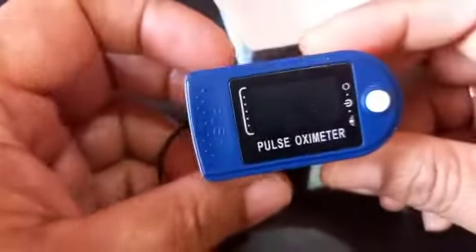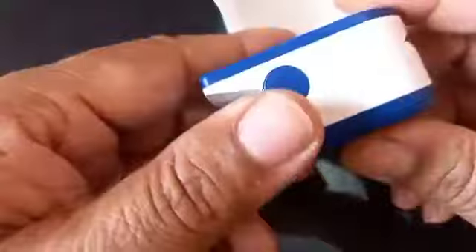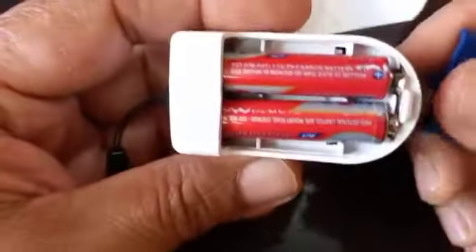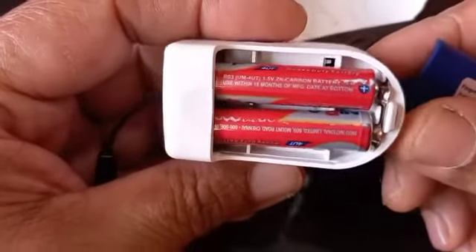Here it comes — this is the Pulse Oximeter. It uses two AAA batteries. Unfortunately, both batteries which came with it were not good, so I have replaced them with new ones.